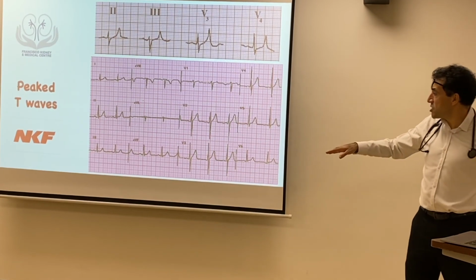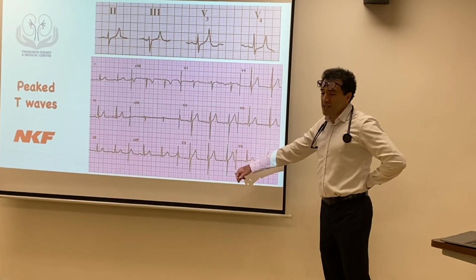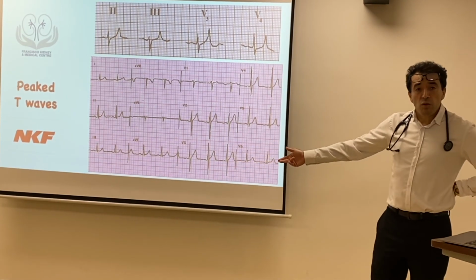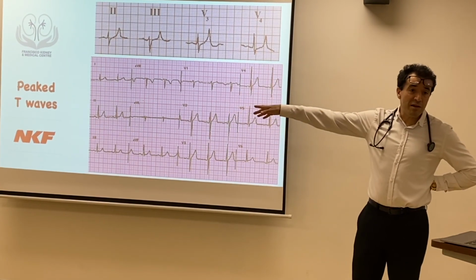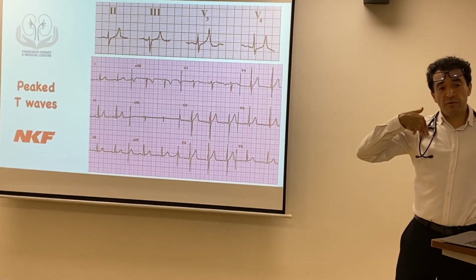But if you're not sure, one characteristic is that it's irregular, then it would be an AF. You might see P waves, and it's irregular. It could be a sinus arrhythmia. Remember the one with the breathing, when you inspire.